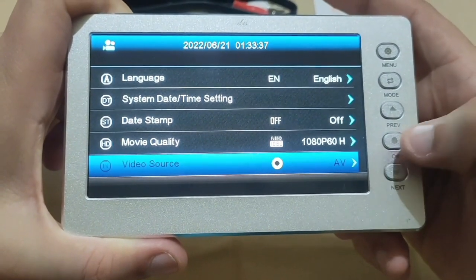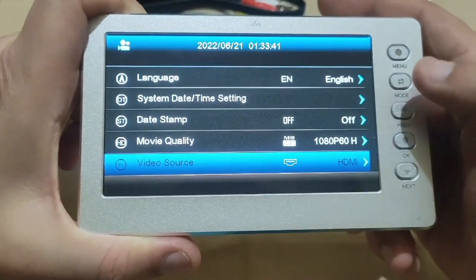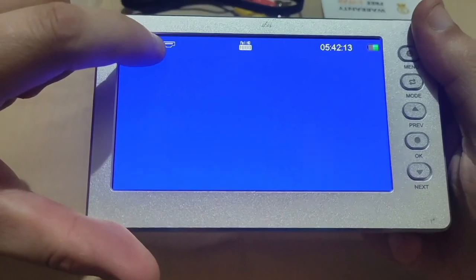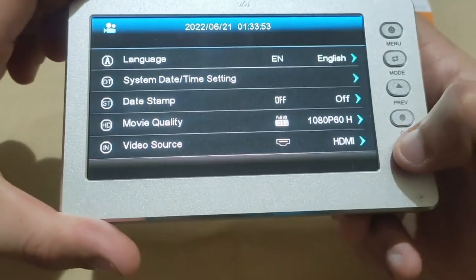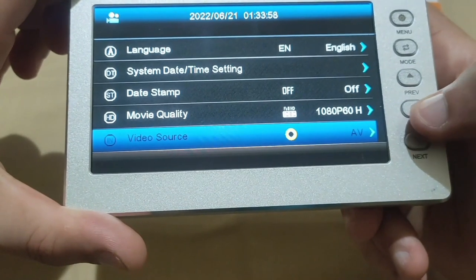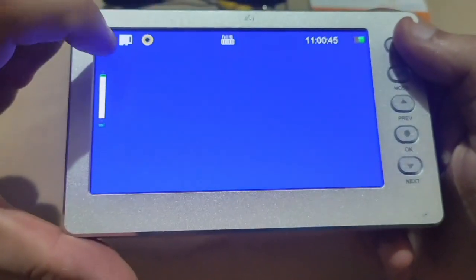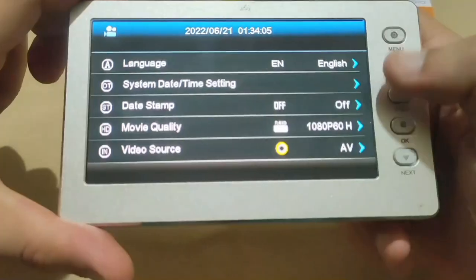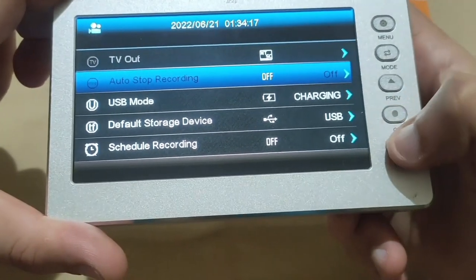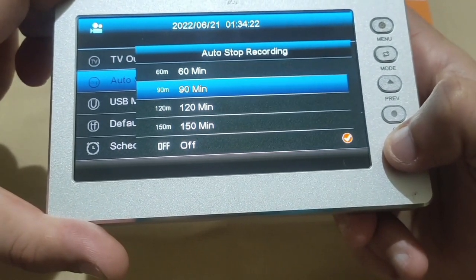To change the video source, go to video source and choose between HDMI or AV. As you can see, the first icon here indicates that the video source is HDMI. If we change video source to AV, now the icon shape changes to AV, as you can see. To change auto stop recording, go to Auto Stop Recording and set the recording time from the available options.